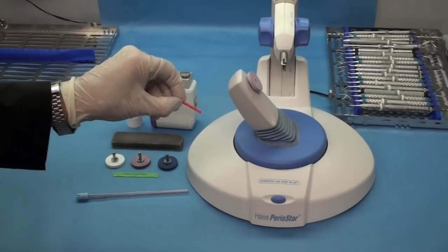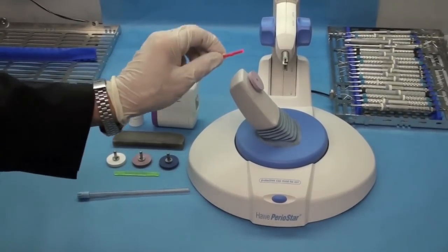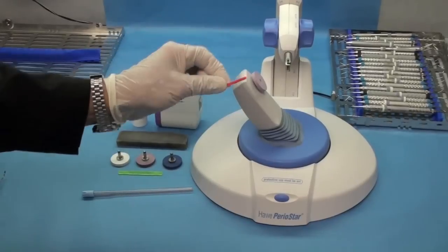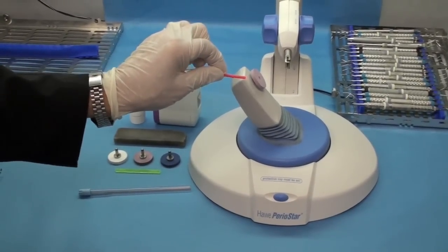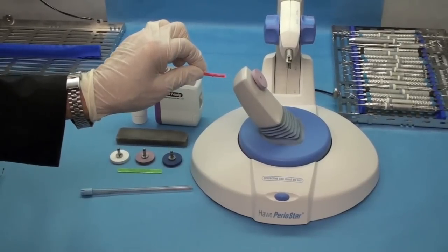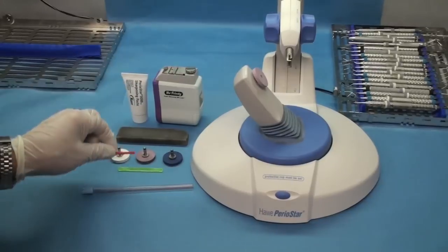This tip comes with the Periostar and it has a little magnet in it. And when you put it on the blade, it'll tip to the right or to the left as to which side the cutting edge is. Or if it stays straight, then you know it's a universal instrument that has a cutting edge on both sides, so you know which side to sharpen.